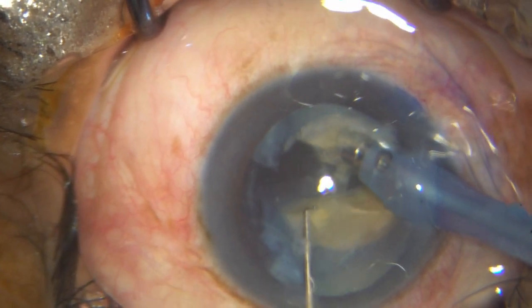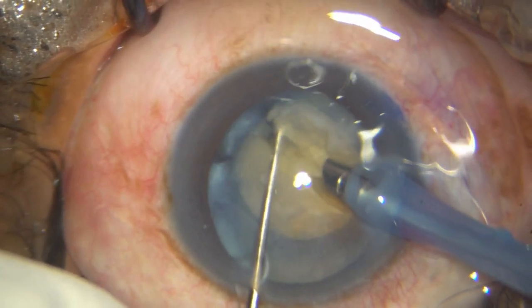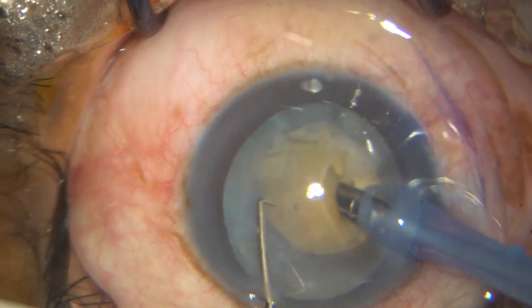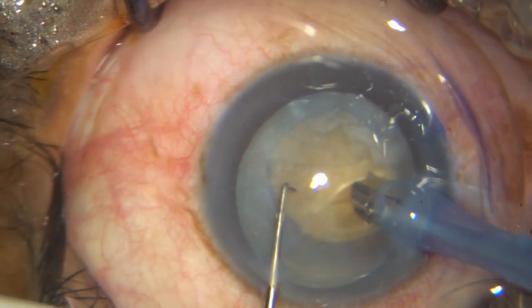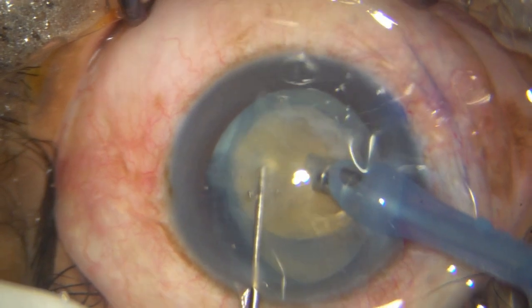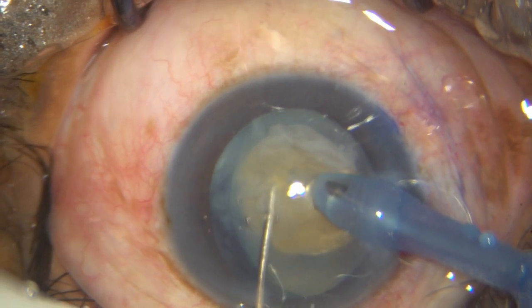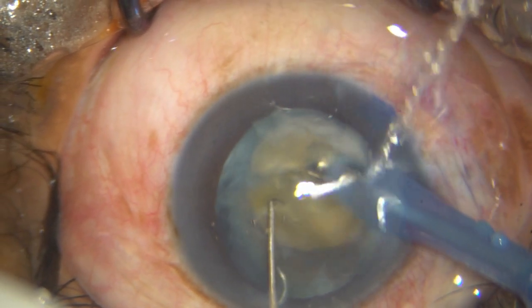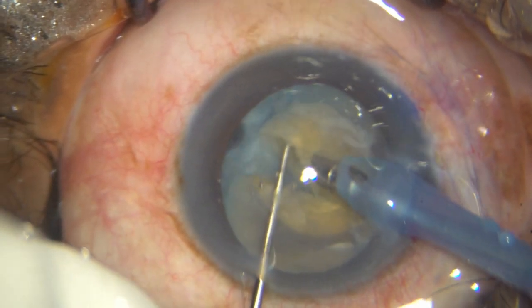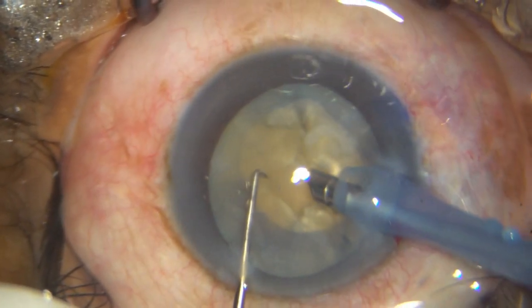That's a complete chop. Yes, I do not expect it to go all the way through. However, this is fairly adequate. So I'm now trying to rotate it 180. Didn't actually go completely 180. That's okay. And look at this chop. As long as you can see the posterior capsule, when you laterally separate, the chop is a good chop. There are some fibers attached in the center. Doesn't matter, we can handle that later.